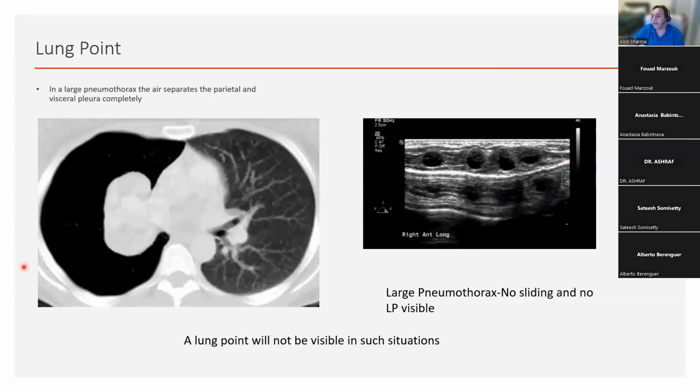Unless you have a pneumothorax that is massive, that has caused the entire lung to collapse, as you can see over here. If the pneumothorax has caused the entire lung to collapse, then you're not going to get a lung point because there's no lung to actually expand. This is a baby we had a few years back, where we were doing this lung ultrasound as we were needling this baby because this baby had a massive tension pneumothorax. I had the probe there, and we just kept the probe there to see if we'd get a lung point back. But this was an A' profile.